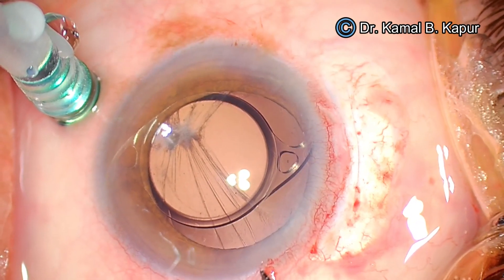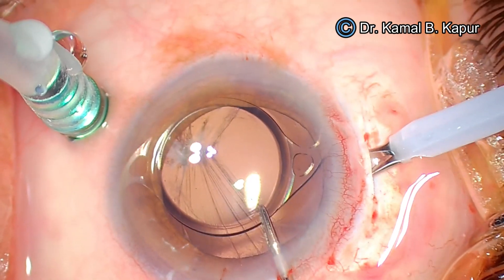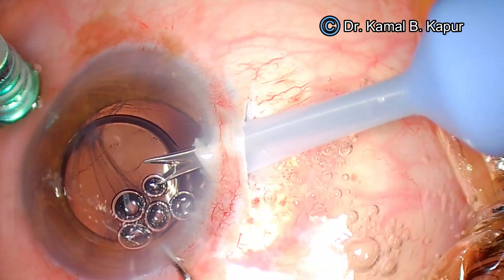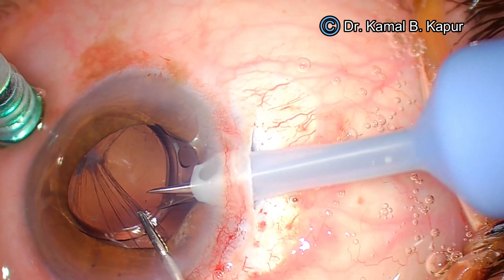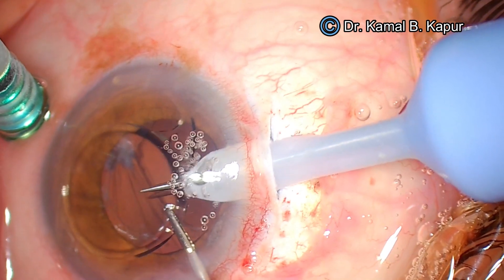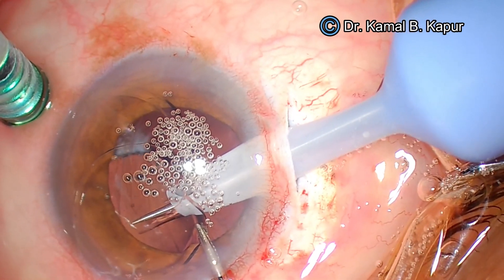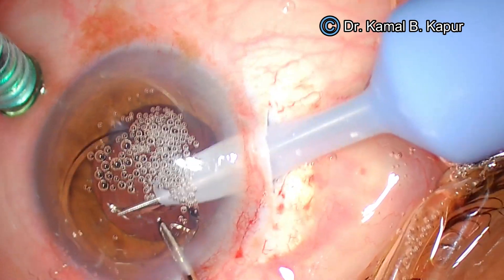When inserting the cutter, it must go flush and parallel to the incision. Once inside the intraocular area, the scissor is rotated and made absolutely perpendicular to the eye. Sometimes the sleeve may get stuck at the wound, so it's a good idea to have a wound size of 3.1 to 3.2 millimeters to avoid descemet's detachment. You then use the micro forceps, available with this cutting forceps, to grasp the IOL firmly and re-grasp continuously as the cutting tip advances forward — getting a better grip each time.